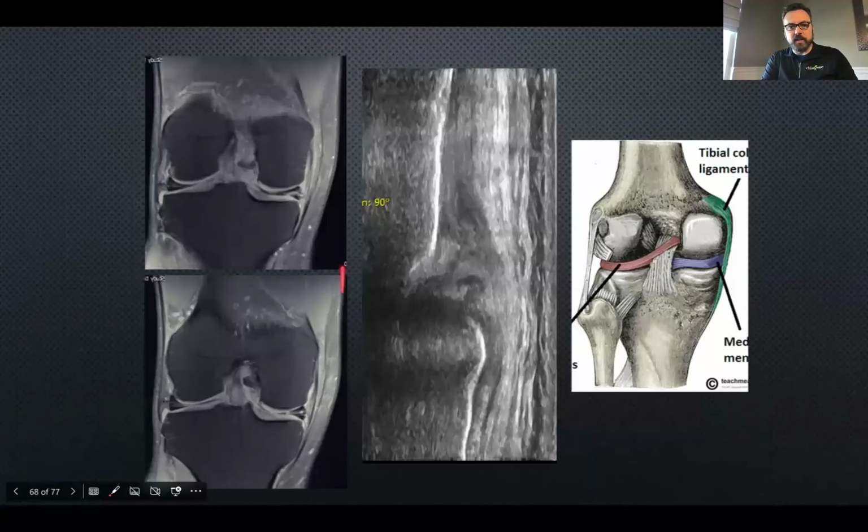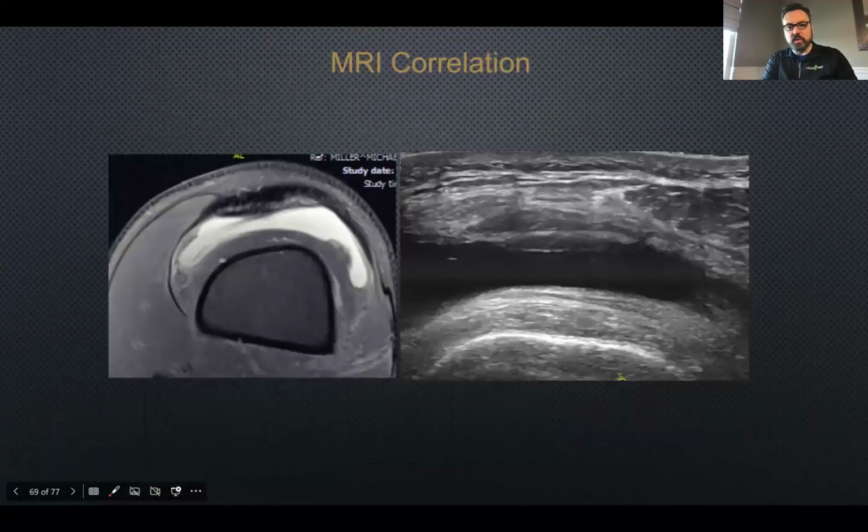Here's the lateral aspect of it. You could see this irregular complex tear involving the body of that medial meniscus. And then you can see here a lot of irregular tearing through the body of the medial meniscus. Femur is right here. Tibia is right there. And then, of course, this is that suprapatellar effusion. You could see it right there.